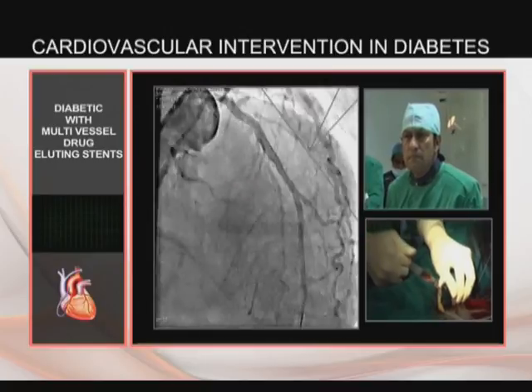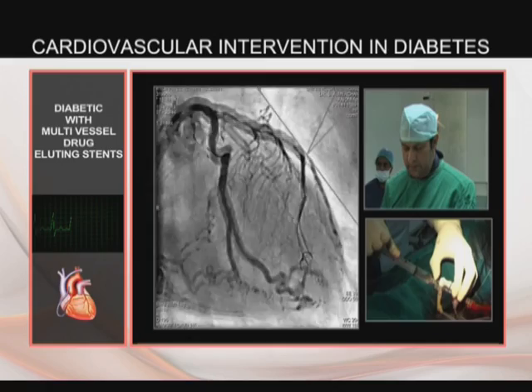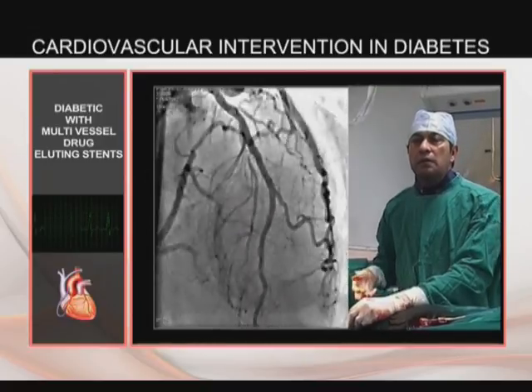This is the final result post dilatation, but you can see the diffuse nature of the disease in the LAD, which is due to the long-standing uncontrolled diabetes.